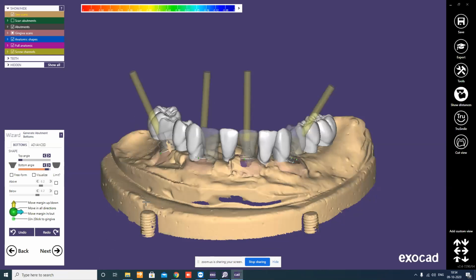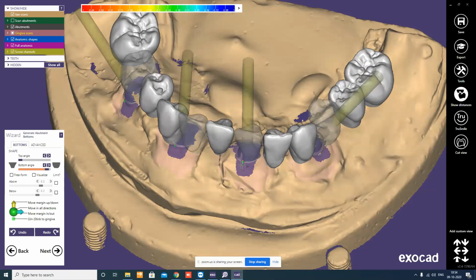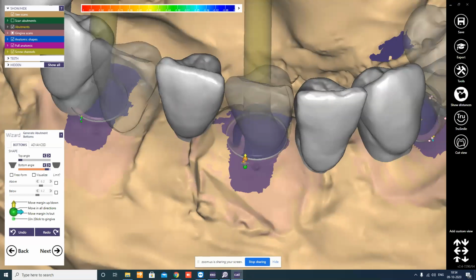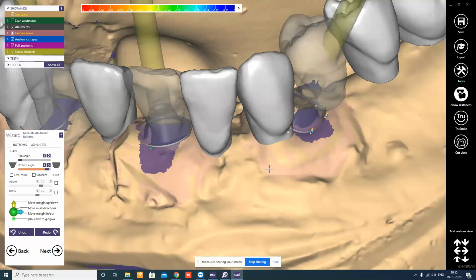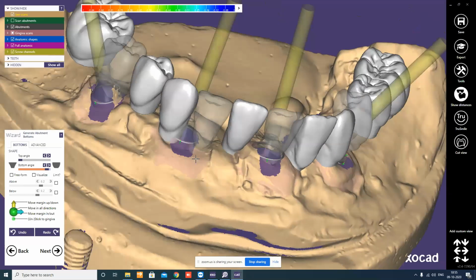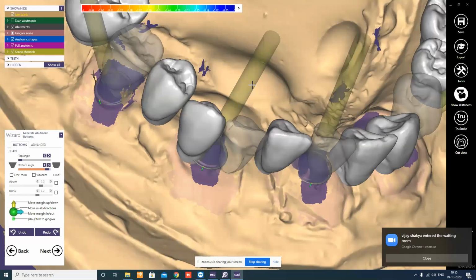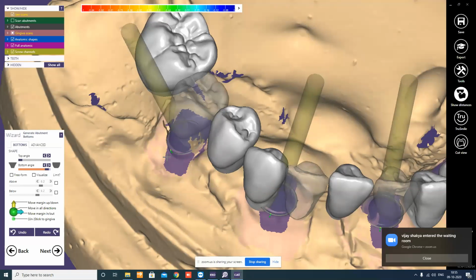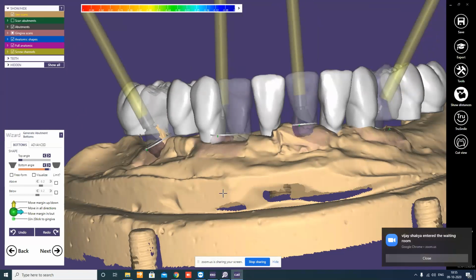And margins, if we are making custom abutments, we want the collars to be defined, so we can just push control and we can have enough resting collar for the prosthesis. So we can do one by one. This I usually do very commonly, because then it helps me have enough collar resting place. Otherwise, you don't have a defined collar. So that is again very dicey.